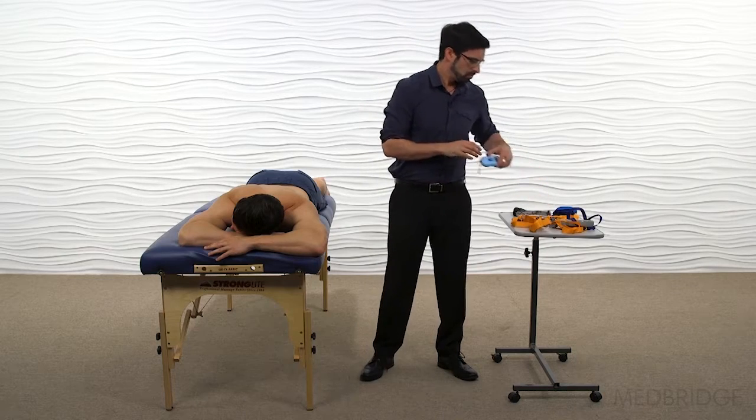In order to do this, we have a couple of tools we're going to use. One option is a luggage weight or a portable scale. We're not going to test with this right now because it doesn't hold or lock in the value. The two I'm going to demonstrate are readily accessible, cost effective, and can be used in the clinic to manually muscle test for strength — the MVIC.